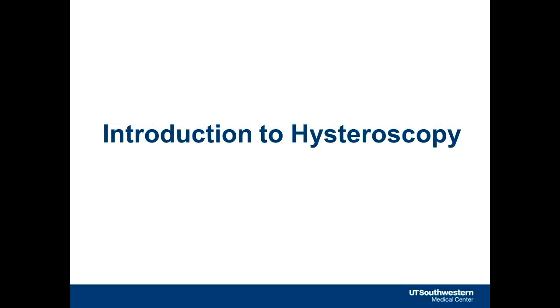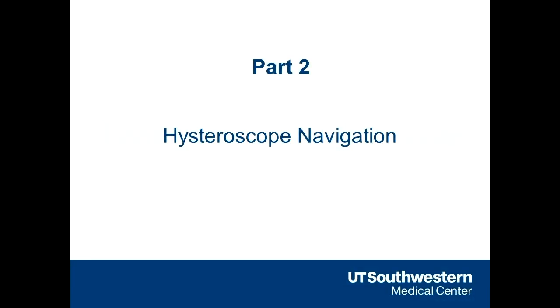Welcome to Introduction to Hysteroscopy. Part 2, Navigation with the Hysteroscope.